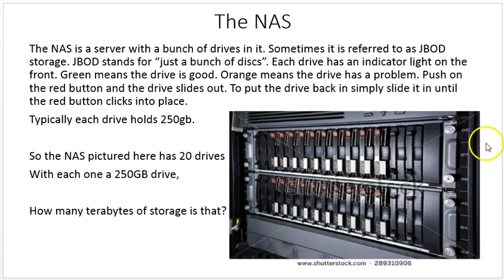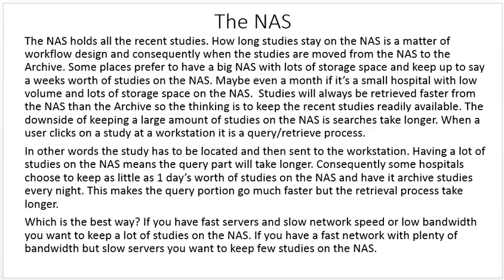This is a picture of a NAS type device here. You can see each of these red buttons represents a drive. Those are all mini hard drives all stuck in there. Typically each drive holds 250 gigabytes, so the NAS pictured here has 20 drives, each one with 250 gigabytes. How many terabytes of storage is that? You figure it out, you tell me. The NAS holds all the recent studies.